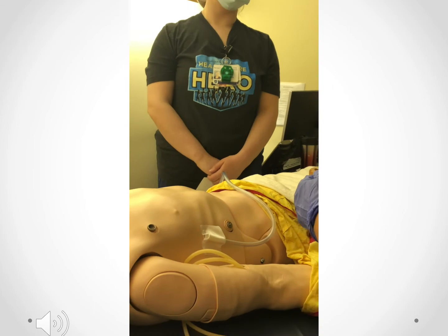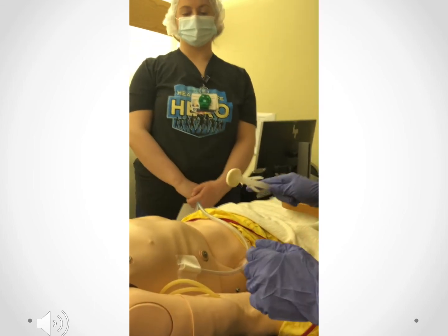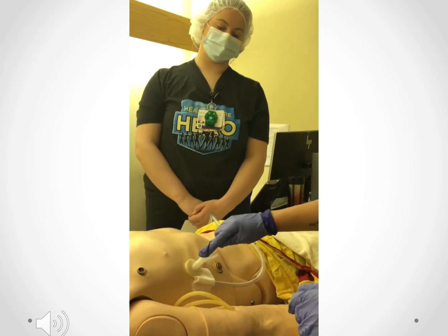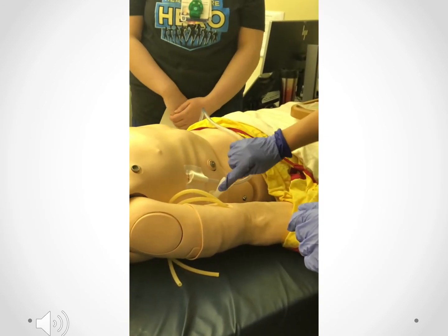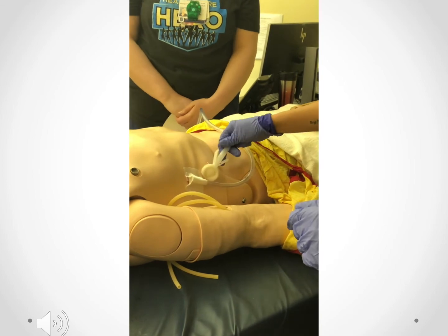So first, Katie will begin with the chlorhexidine swab to clean the site around the tube, and also make sure you clean on the tube as well, for some of the tube is underneath the dressing.